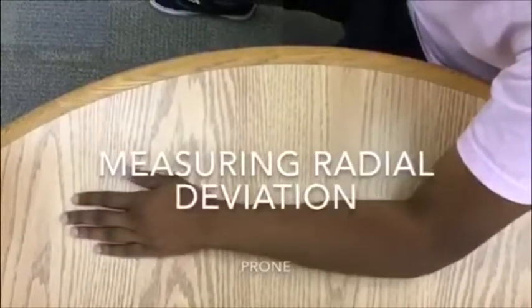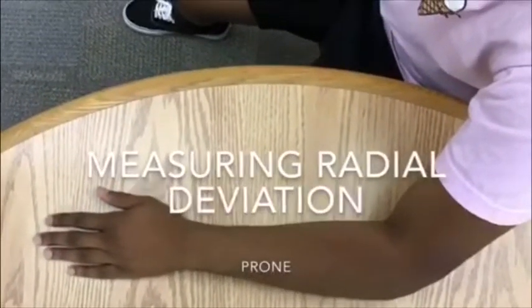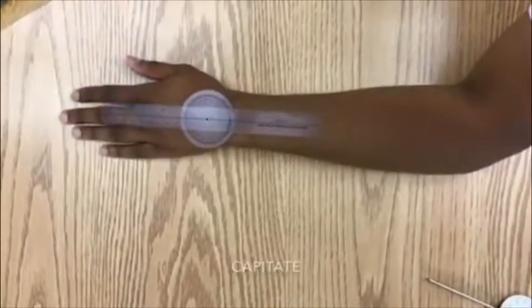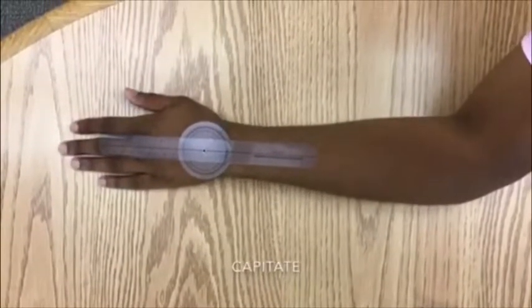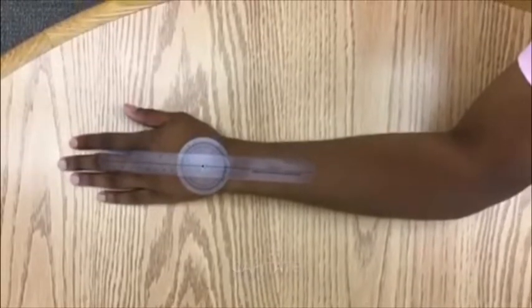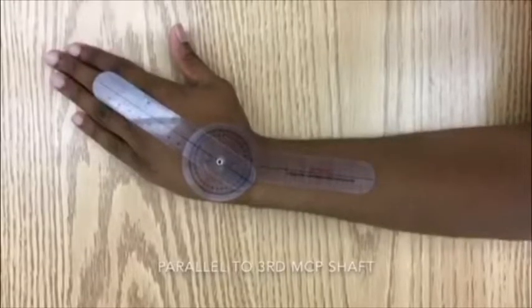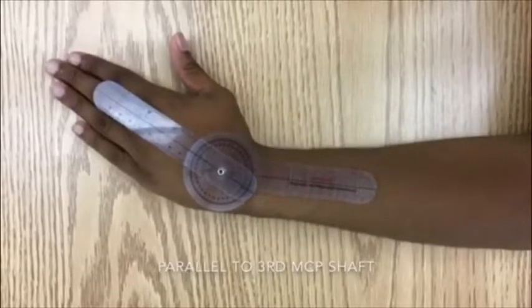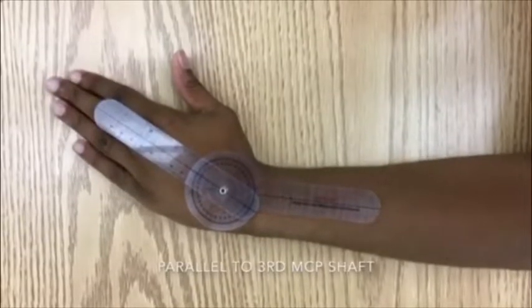To measure radial deviation, start in the same position as ulnar deviation, with the axis of the goniometer centered over the capitate and the stationary arm along the forearm midline. Have the patient radial deviate. Adjust the movable arm of the goniometer to be parallel to the longitudinal axis of the third metacarpophalangeal shaft.